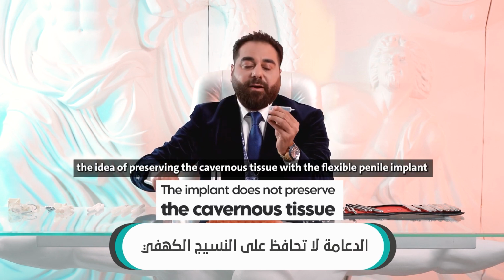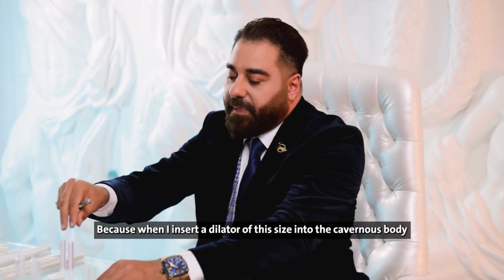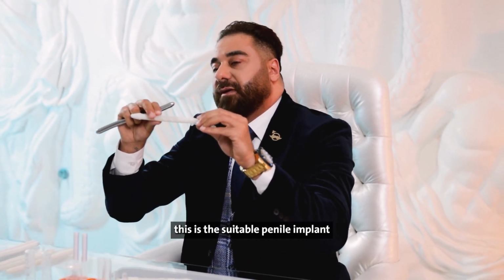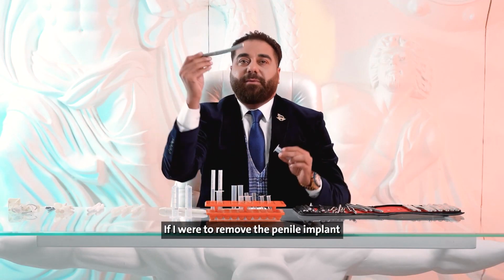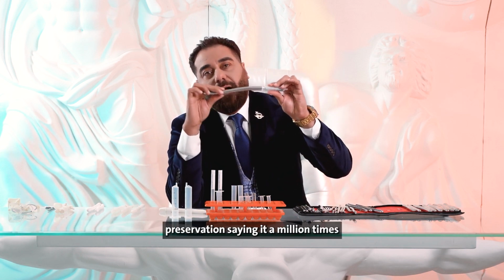Therefore, the idea of preserving the cavernous tissue with the flexible penile implant is entirely impossible. Why? Because when I insert a dilator of this size into the cavernous body and find it smoothly inside, this is the suitable penile implant. This means that it is wedged in, implying that it has destroyed the tissue around it. If I were to remove the penile implant, there would be a void that would be filled with fibrotic tissue. So there is nothing as tissue preservation, saying it a million times.